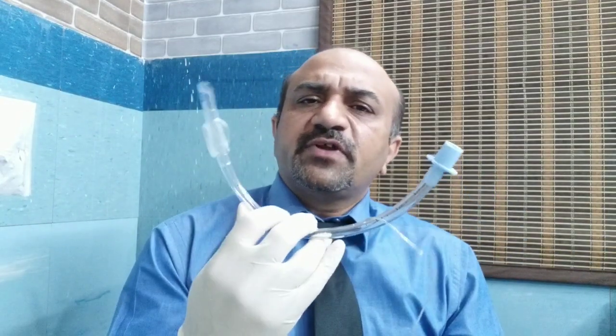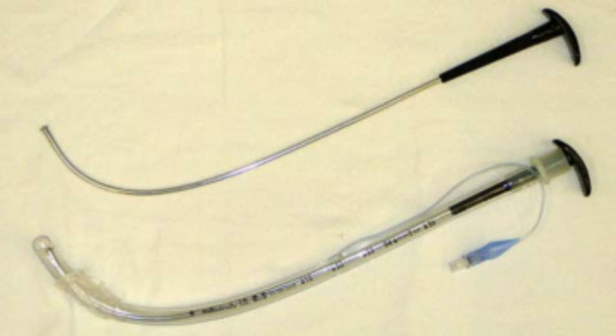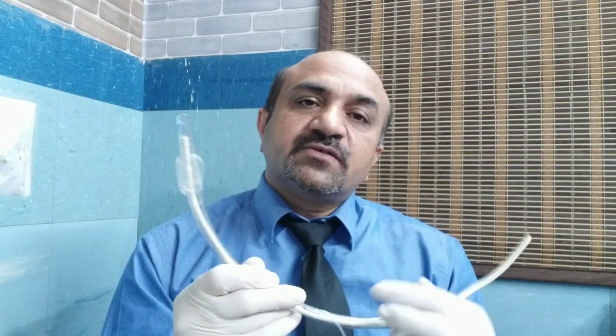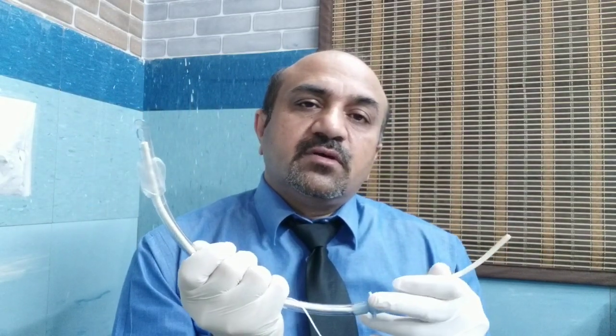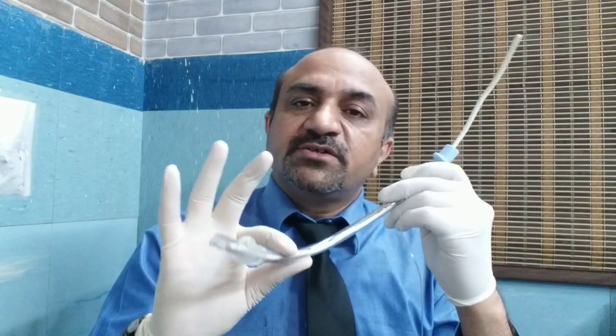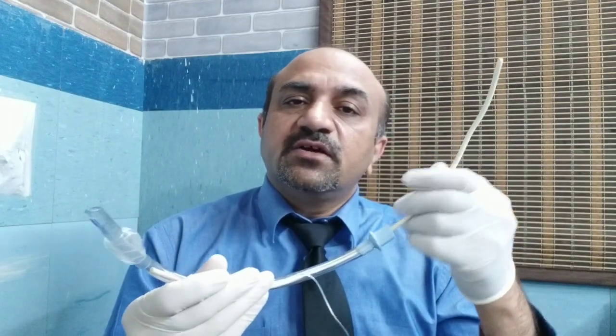If you notice, this is a very flexible tube. Whenever you are passing it after applying gel on this part of it, there is a chance that it will just have a kink. So in order to keep it straight, we use this stylet, which has 2 ends. We take care not to let it pass beyond the Murphy eyes. We just keep it before that, so it doesn't damage the trachea. It will keep the endotracheal tube straight rather than being very flexible. So having a stylet is very important in order to pass the endotracheal tube.